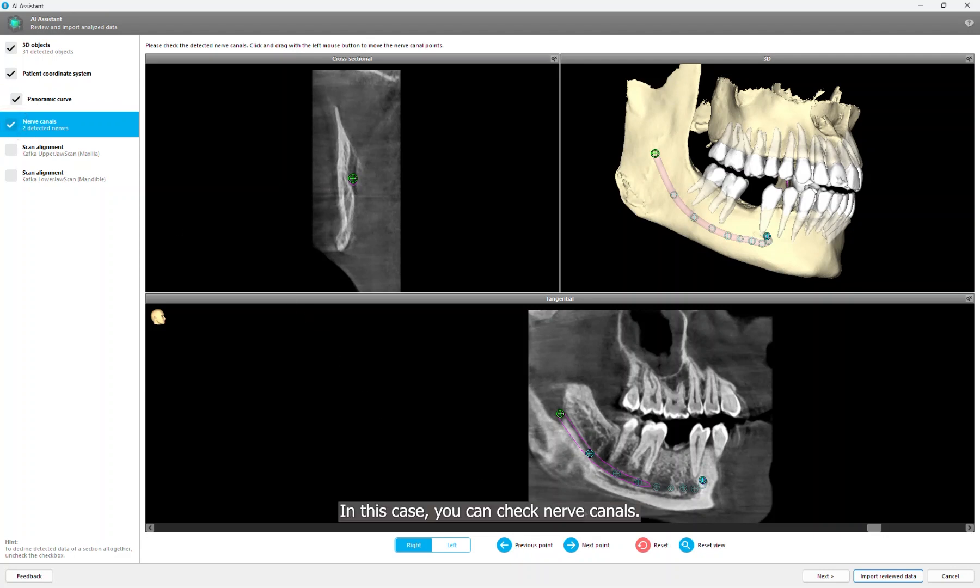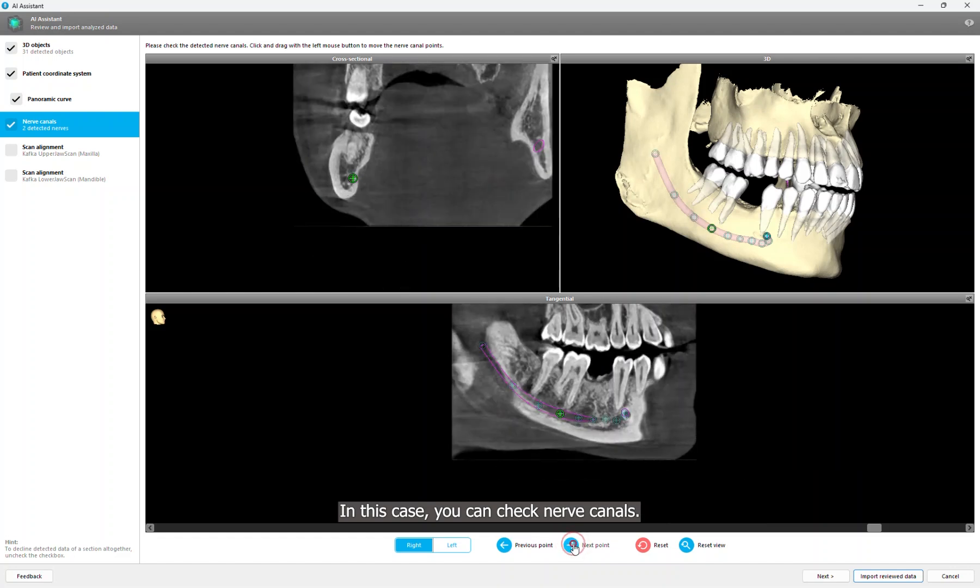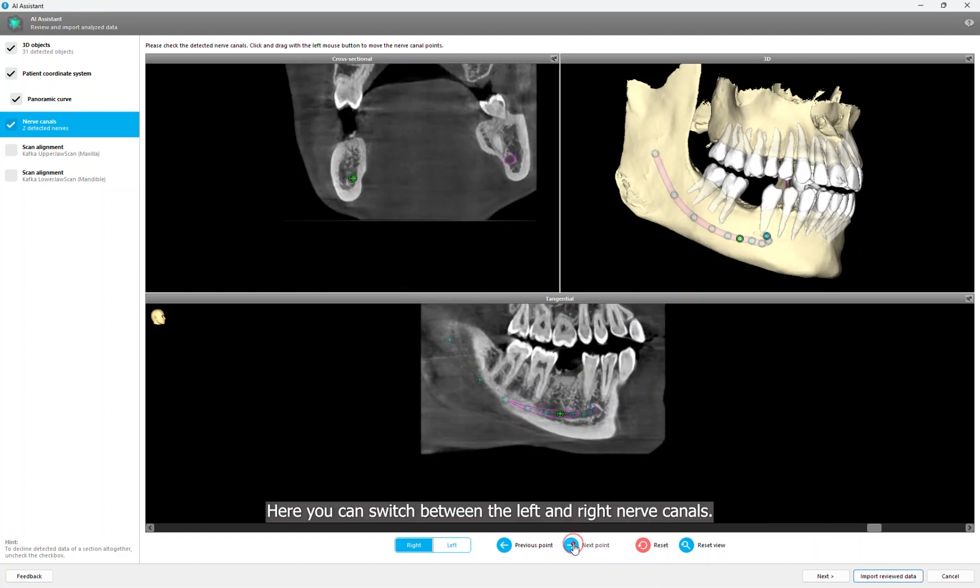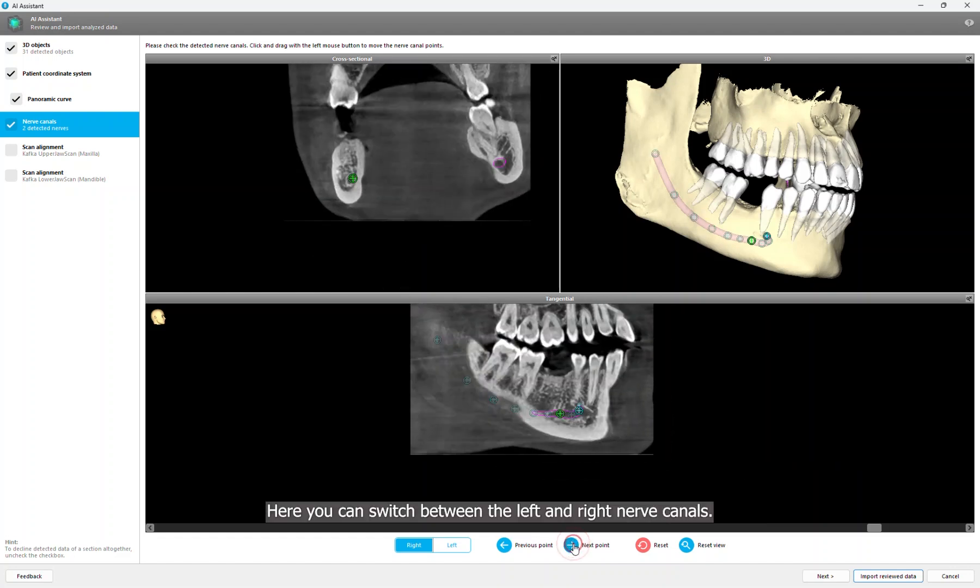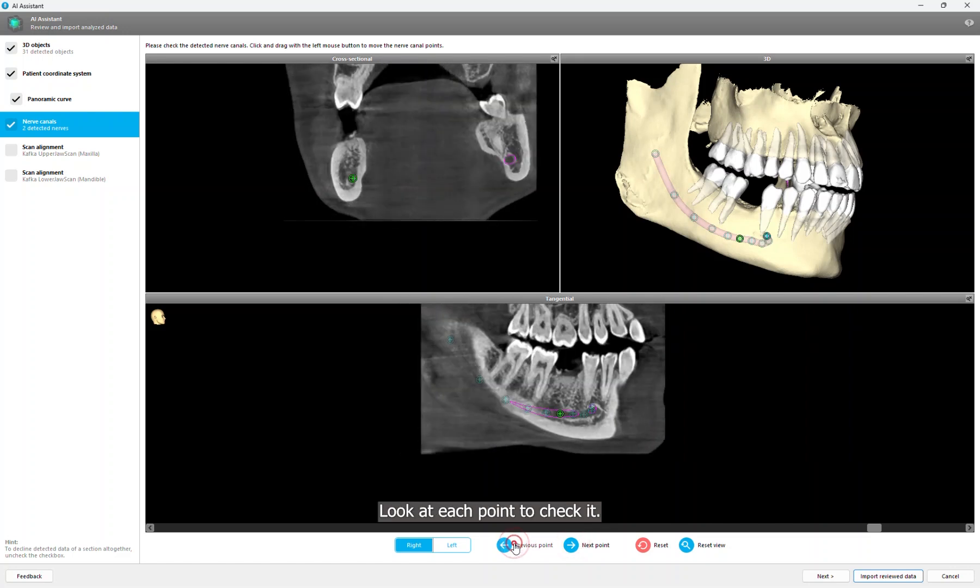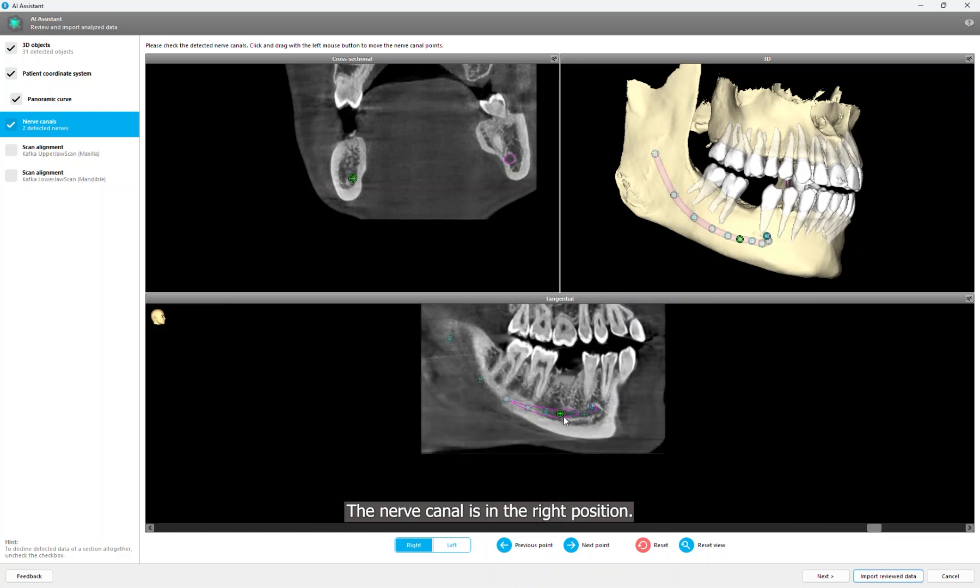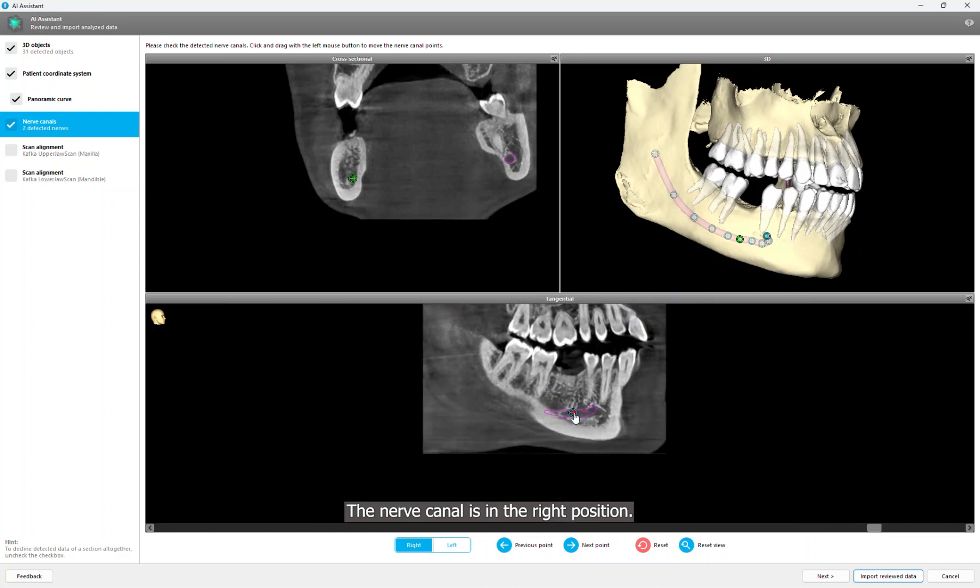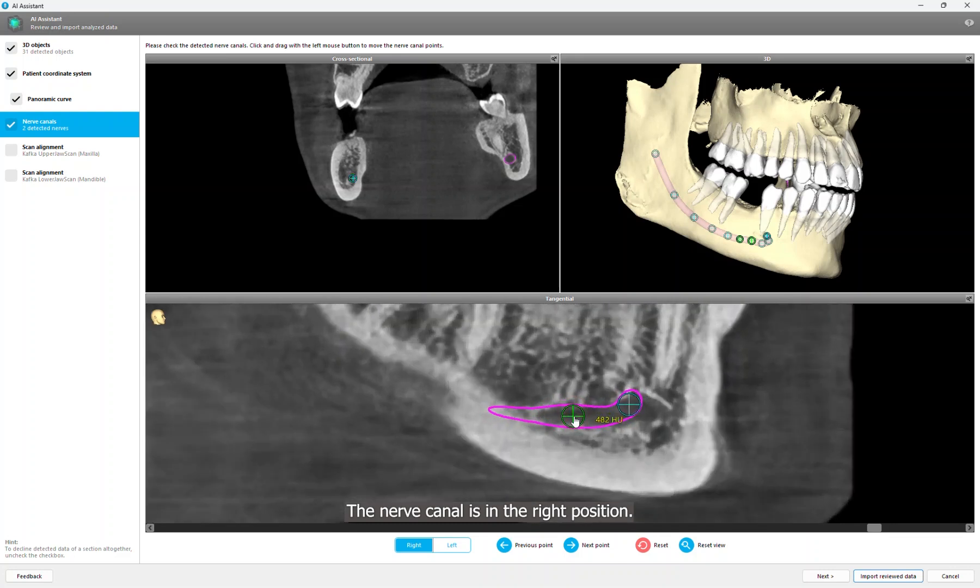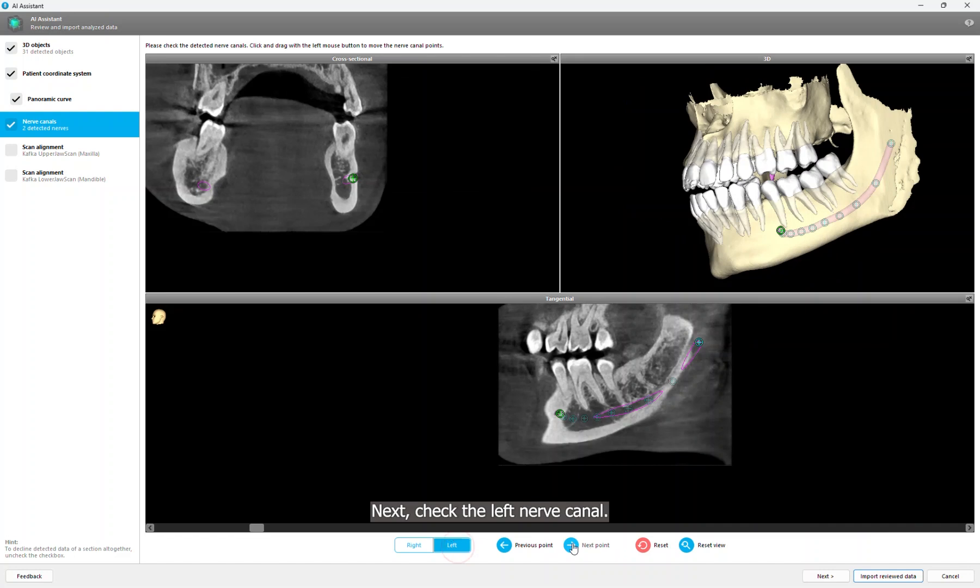In this case, you can check nerve canals. Here you can switch between the left and right nerve canals. Look at each point to check it. The nerve canal is in the right position. Next, check the left nerve canal.